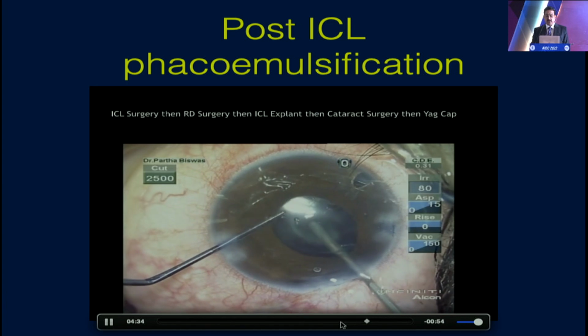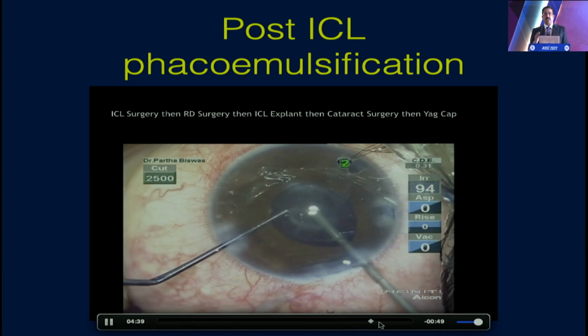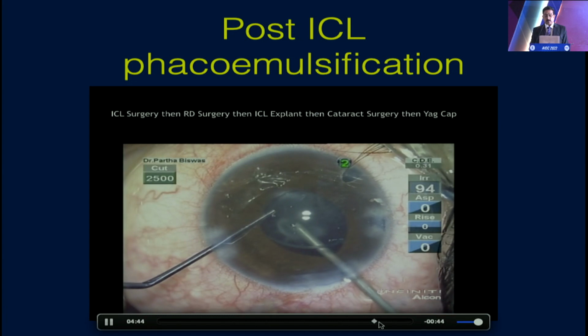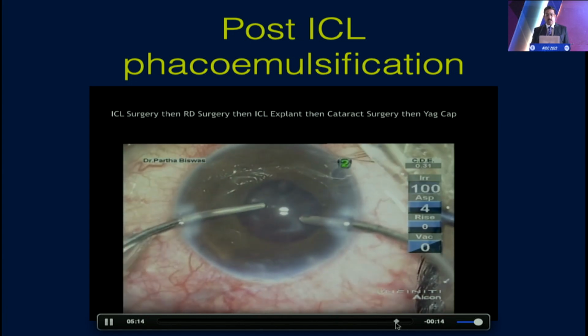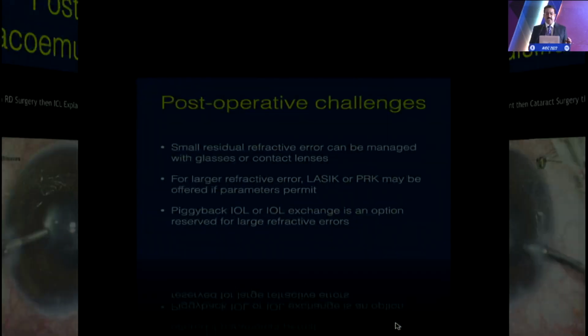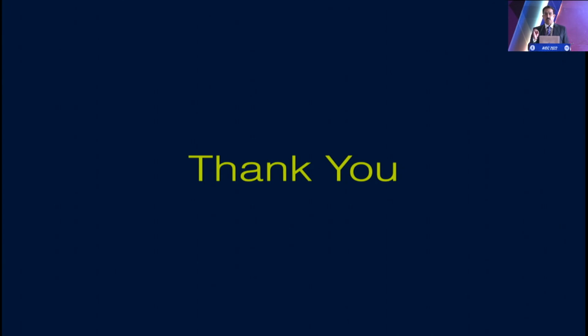And so after this, the patient, of course, did not gain 6/6 vision, but had a good vision of about 6/24 and N12. So just to show that these situations might not arise every day, but it can happen, and when it does happen, then things have to be taken in the light of that particular patient, with all the importance given to the refractive analysis and the workup, as well as the surgical technique and the pre and the post-operative counseling.